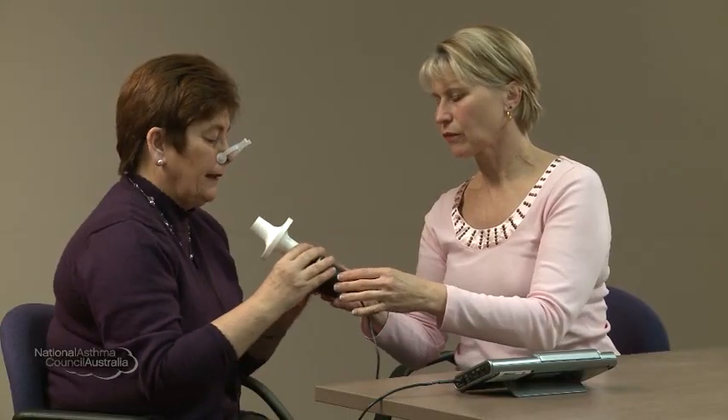So Joan, we just need to pop this nose peg on your nose. A bit uncomfortable — you all right there? Good. If you just hold the mouthpiece there. And when you're ready, I want you to have the biggest breath in you possibly can.